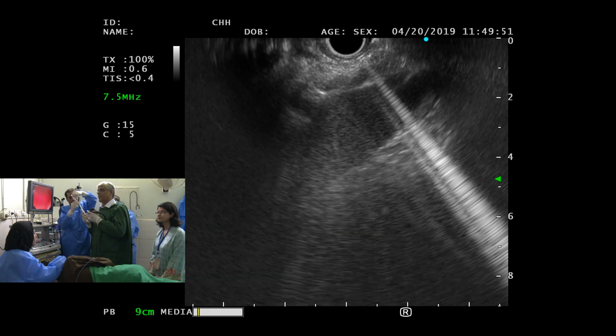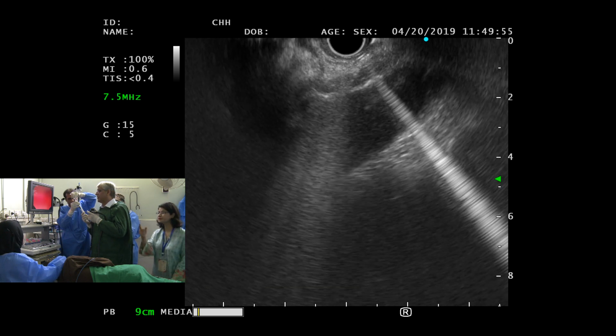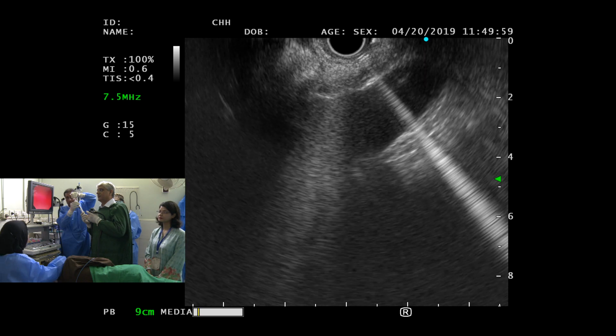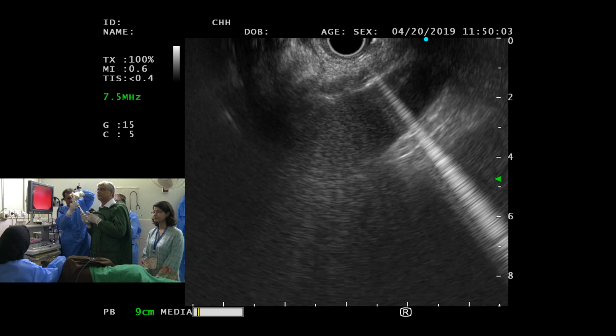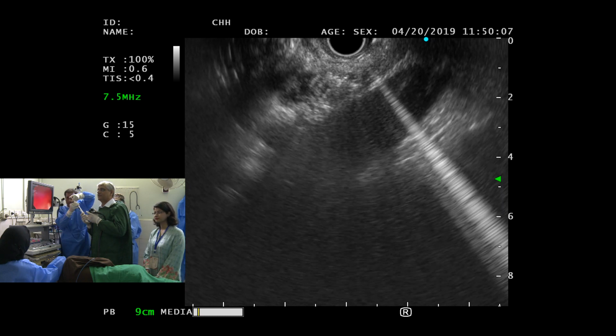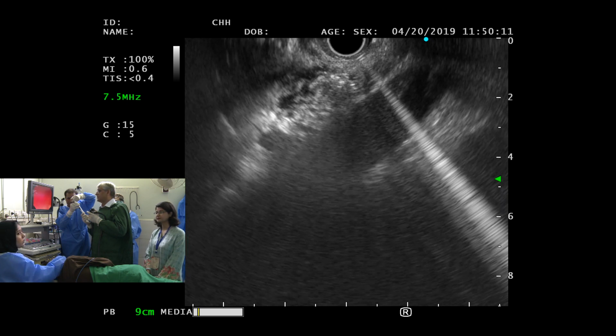Right. Yeah. You locked the needle too. Yeah. First test. So first you aspirate, make sure there's no vessel there. No, and yeah, go inject. Yes, start and inject, sir. Yes, see, this is what happens when you've injected a bit of saline, it all goes white. That's what I meant. Continue. So that should be enough.